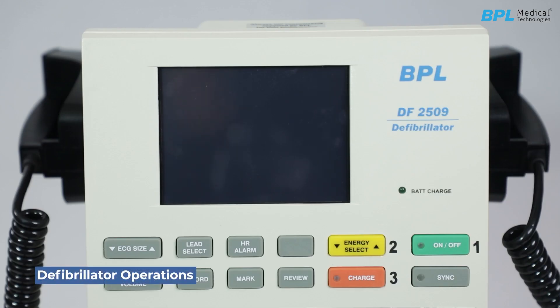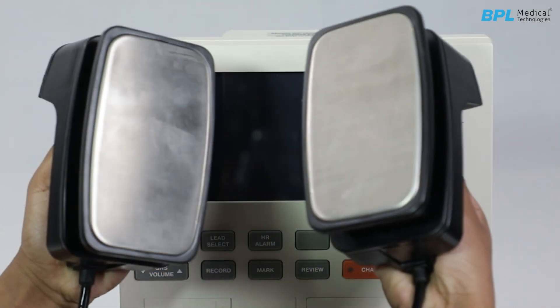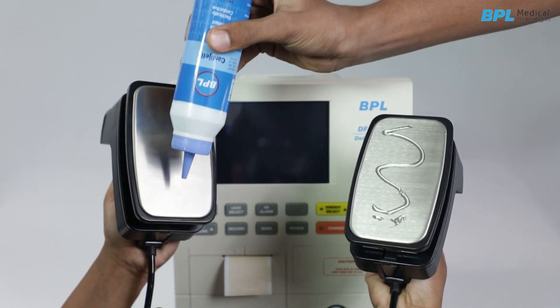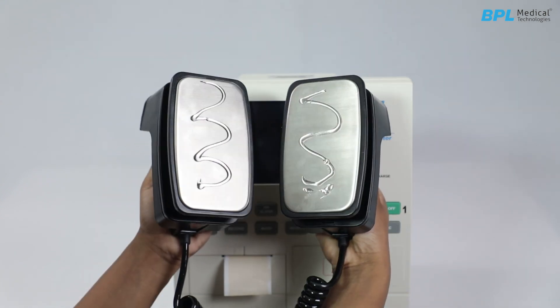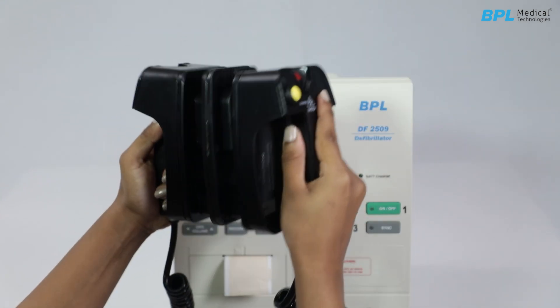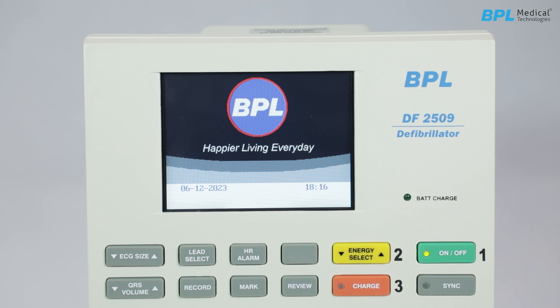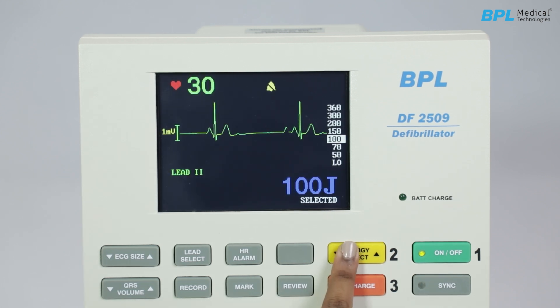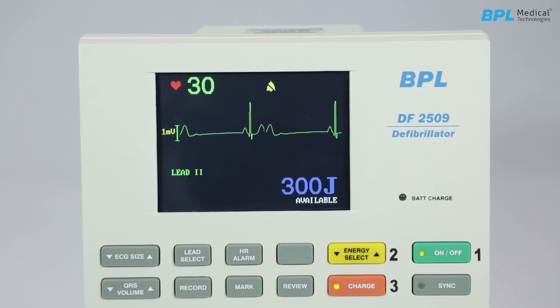Defibrillator operations — preparing paddles and turning on. Remove the paddles from the holder by sliding them backwards and up. Apply electrolyte paste to both paddle surfaces. Press the on/off key to switch on the unit, then select the energy level. Press the charge key on the front panel or the apex paddle. The defibrillator initiates charging, displaying the increasing energy level on the screen.